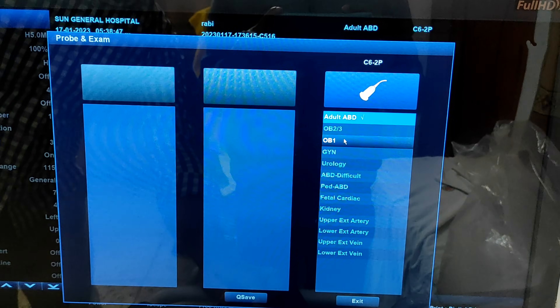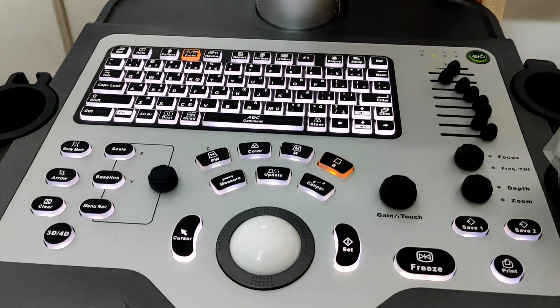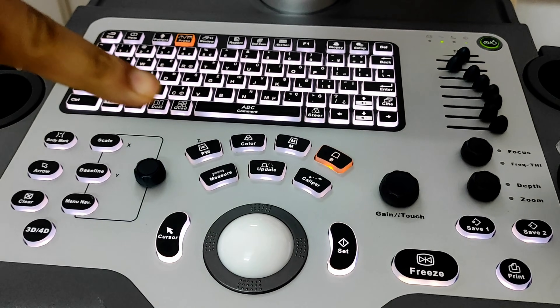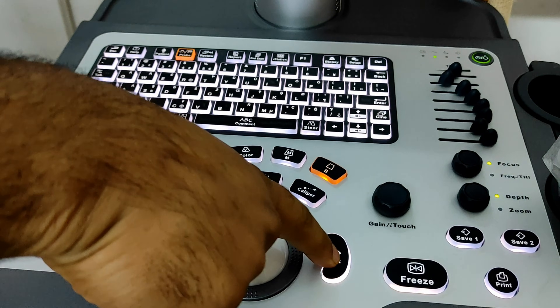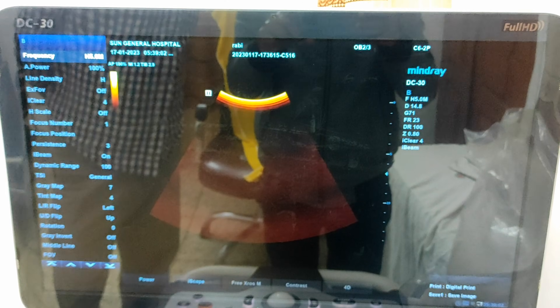To move into a specific section, you have to select the probe and click on that system. I have selected obstetrics second and third trimester and clicked the set button. Now we are in the obstetrics second and third trimester.